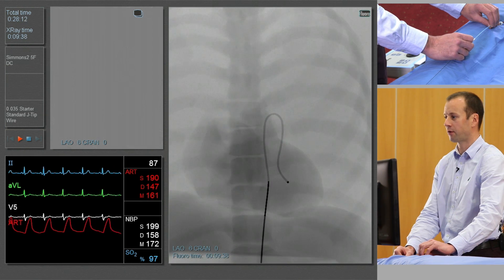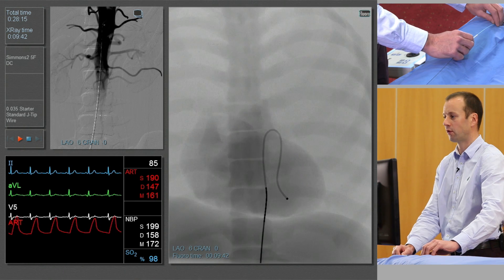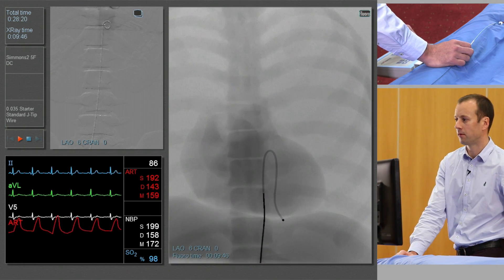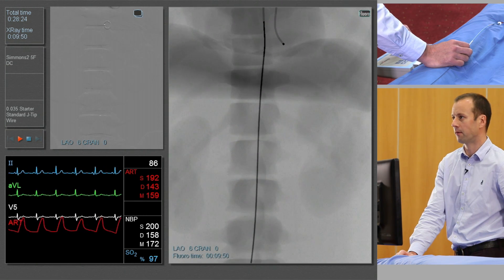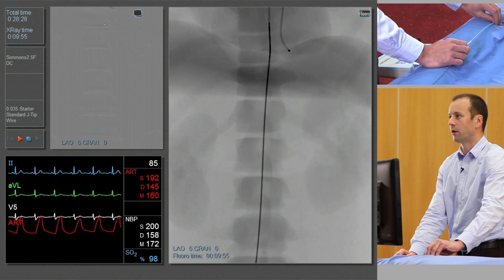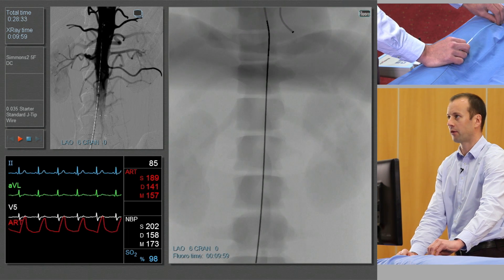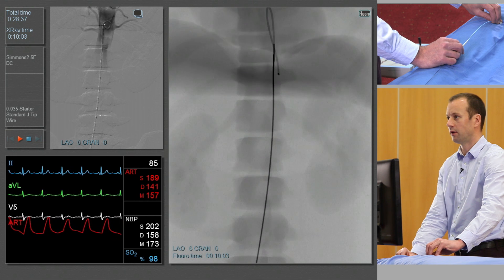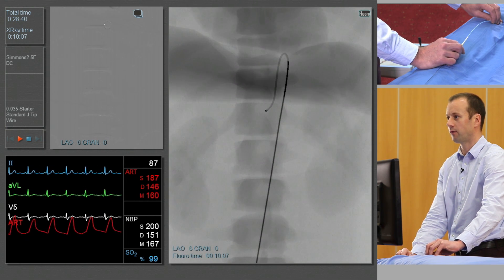We'll keep it pointing laterally to try and help it from engaging other vessels that we don't want to see on the way down, and re-centre over the target area. So as we pull the catheter south, we're going to turn it so the tip of the catheter is pointing anteriorly, and this will allow it to engage probably the celiac artery first.